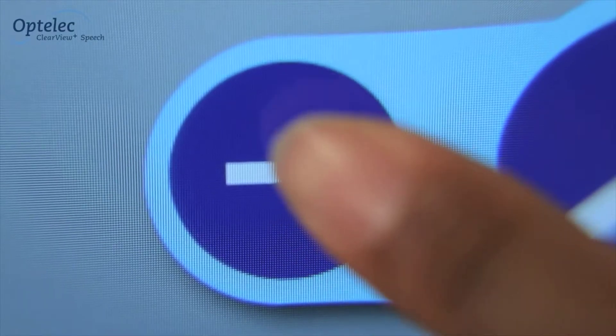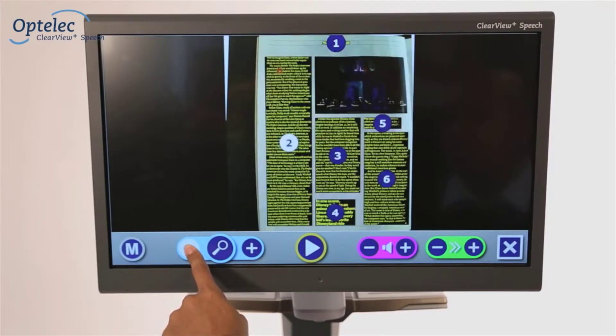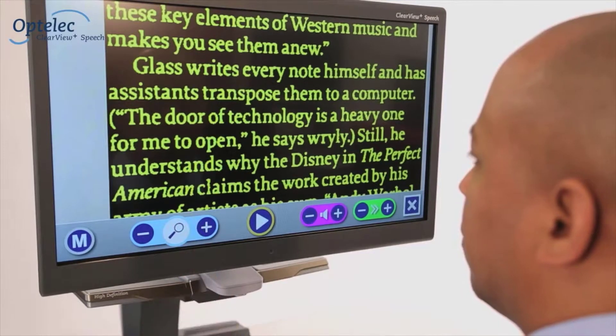The touch screen allows you to increase and decrease the size of your documents. Selecting the magnifying glass will take you back to a full-page overview of the whole document.